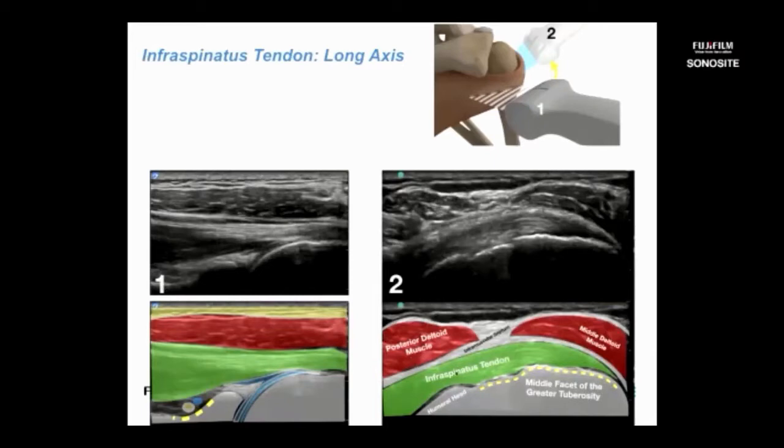One pitfall when you're scanning the distal infraspinatus tendon, as that tendon wraps around, you may get this dark shadow in the center of the tendon, and very, very commonly you're going to be scanning under this little deltoid septation here. So this connective tissue here can lay down kind of an edge artifact on each of its sides, or just the sheer change in density going from a fluid-filled muscle on both sides to relatively less than fluid-filled densely connective tissue structure. You're going to end up with a slight refractile change in how the ultrasound beam is portrayed here.